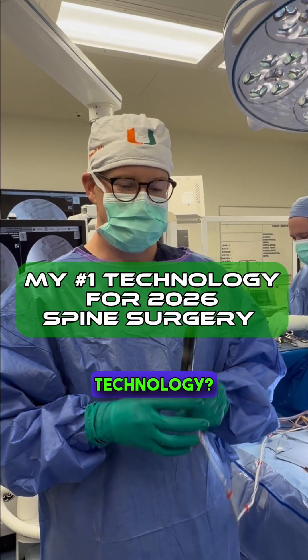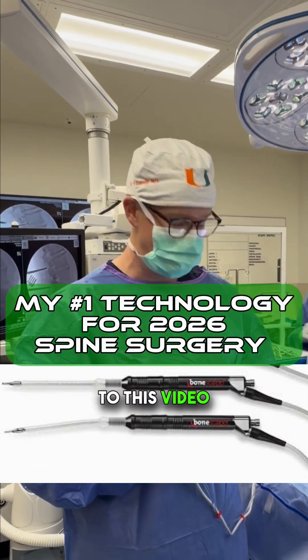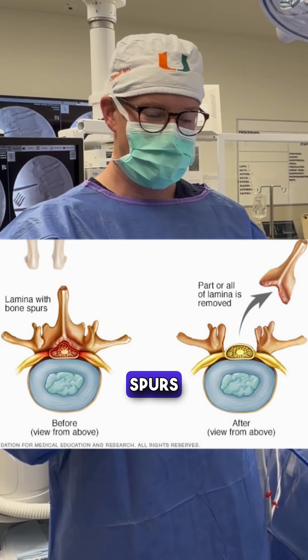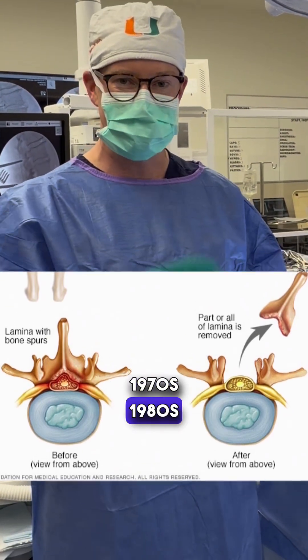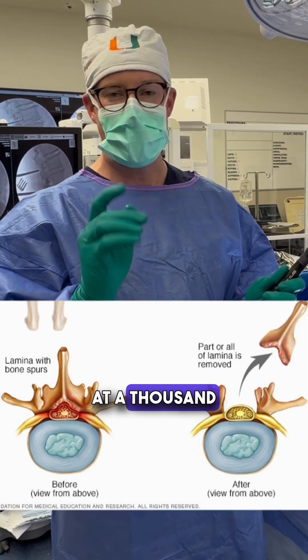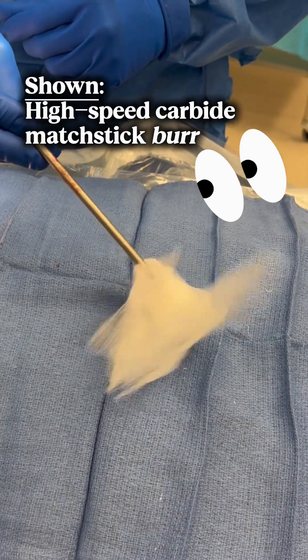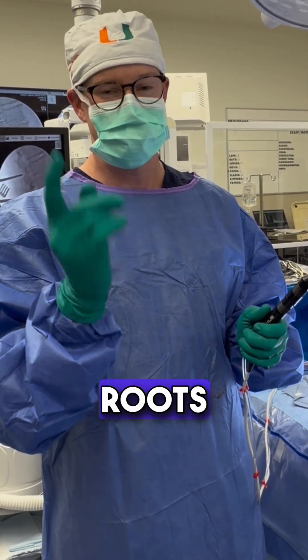You know what's a really cool technology? It's the bone scalpel from Bioventus — and I have no ties to this video. Normally when we're doing something called a laminectomy and taking down bone spurs, we use this burr. That technology is pretty much from the 1970s and 1980s, rotating at a thousand spins per second. It's a great tool I use all the time, but I can catch nerve roots and spin them up.